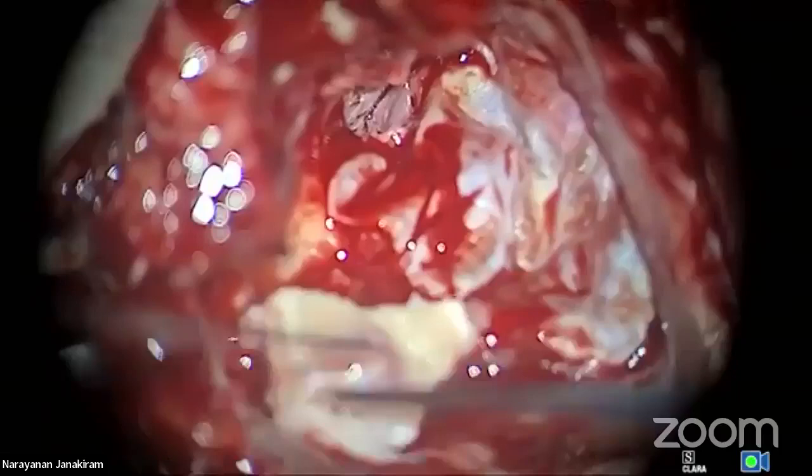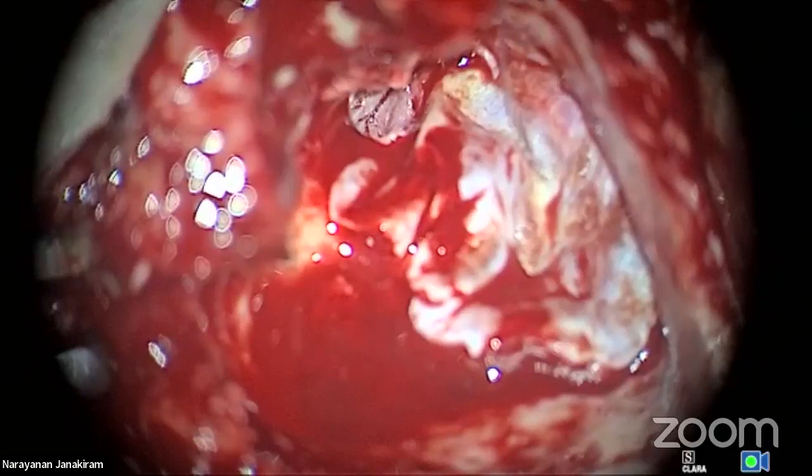Give the skin. Knife. Now I took a little skin as a free flap, right? I'm going to use that as a free skin graft. See that? Oh, this is diseased. See that? Oh, very diseased. I'm just going to use just a little skin.